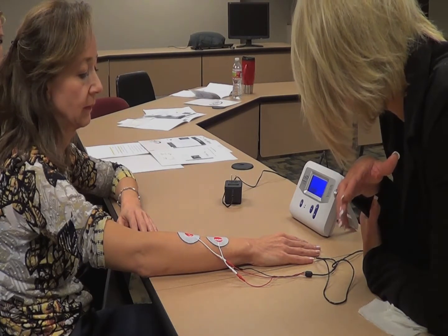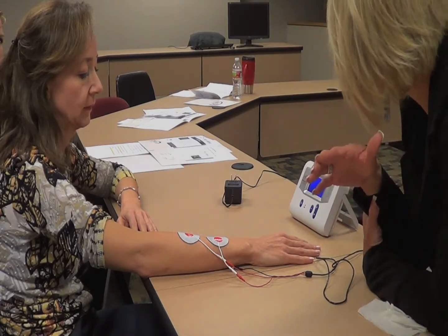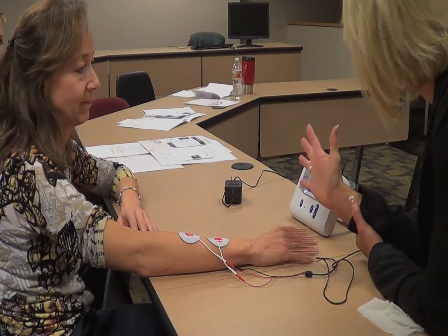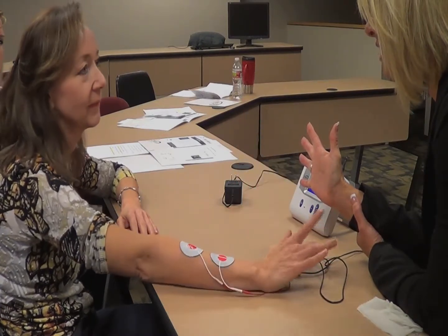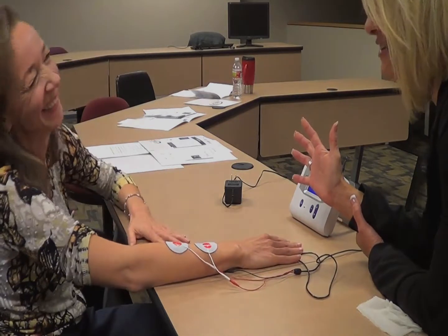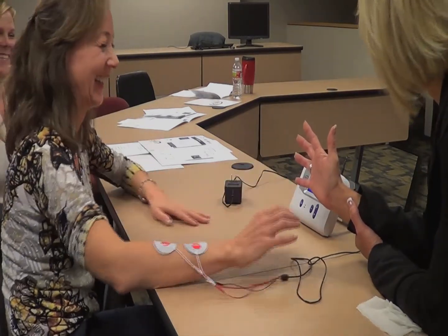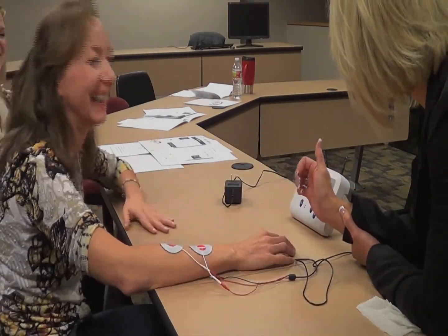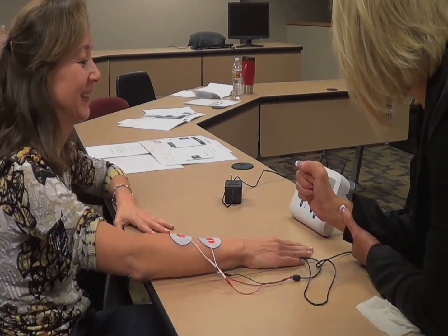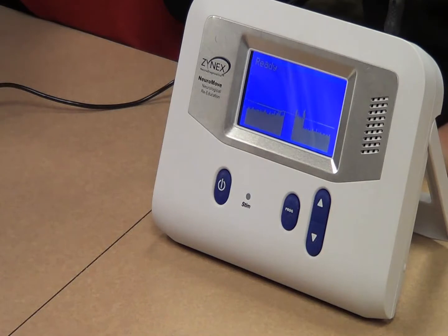Okay, let's do that again. You have some real nice straight muscle noise there, so let's go ahead and do it again. Good. See how easy it is for you now? Sorry, we might have a little flopper. Pretty stimulating. I had the rock and then I fell. Okay, let's do it one more time. See, we want it to get nice and flat.